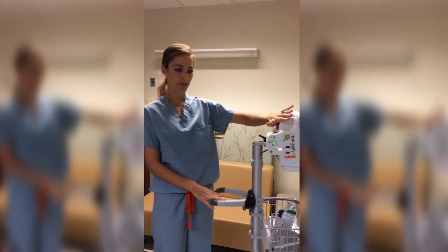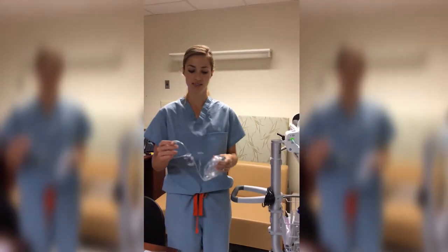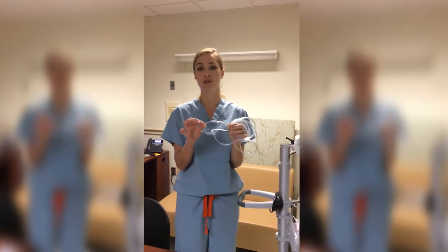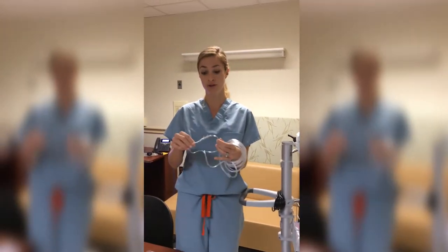With the capnopod on the monitor and the filter in place, we look to our supplies. You have three different options to monitor capnography, and you want to use your nursing judgment to decide which one is best for that patient, because all of them are available to you.